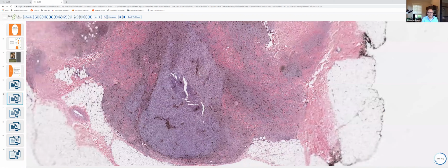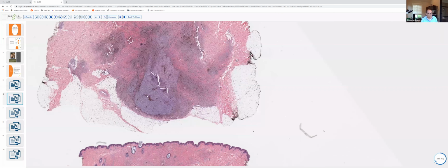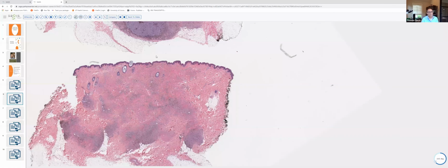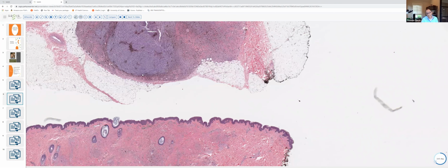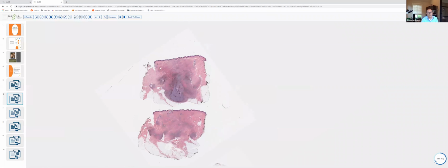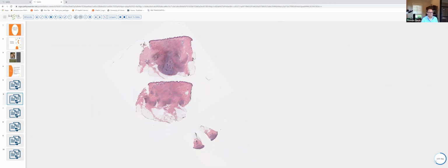Centrally located, more cellular, packed, lighter staining areas, and these are embedded in a fibrotic periphery containing melanophages, dendritic melanocytes, and spindled melanocytes, which tend to be very heavily pigmented. In a cellular blue nevus, there are typically few, if any, mitotic figures evident. So, if you start seeing a lot of mitotic figures near the base, you need to be more concerned about melanoma, especially if there's necrosis there.